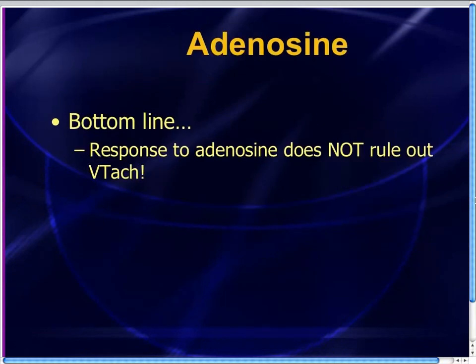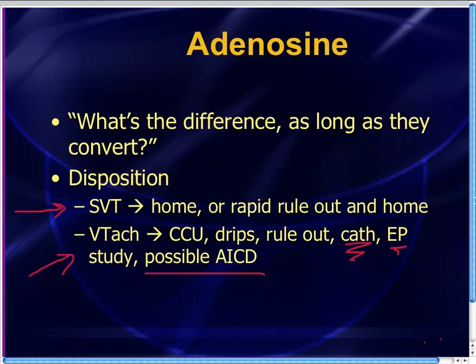And the last thing you want is to end up assuming it's SVT and treating them like an SVT, sending them home, and skipping what really should be an appropriate ventricular tachycardia workup. So be very, very careful about making any conclusions just because somebody converts with adenosine.